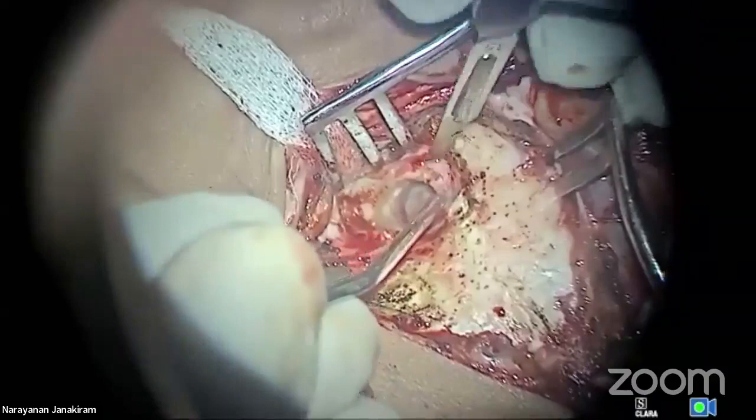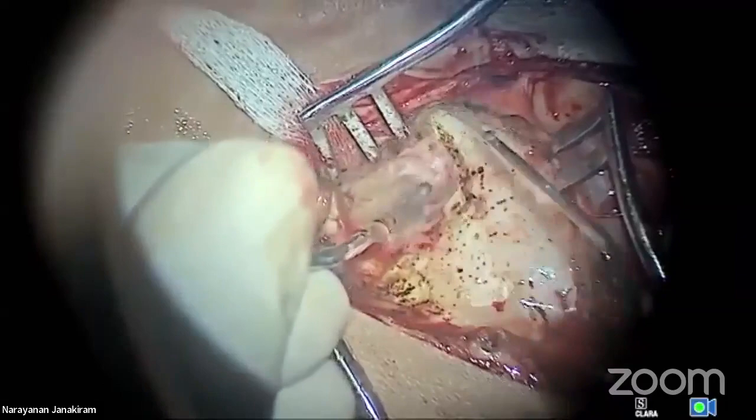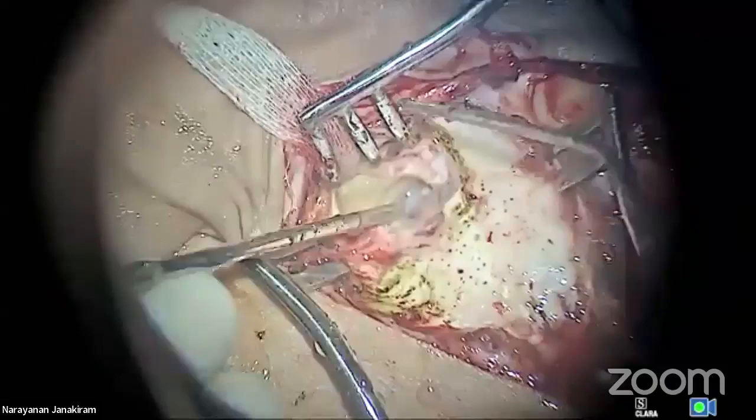Give me irrigation. So the exposure is over. How many minutes does it take? It took another 2.5 minutes. Okay. And then the next segment three starts with a good irrigation. Here is where we irrigate, fanatically irrigate.